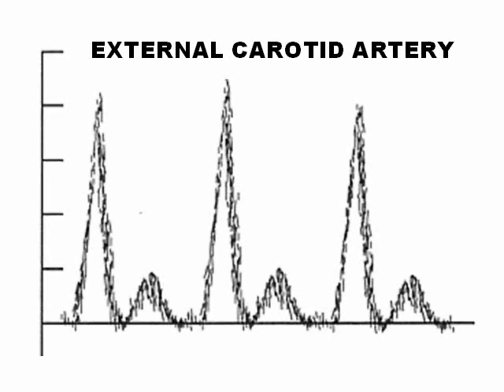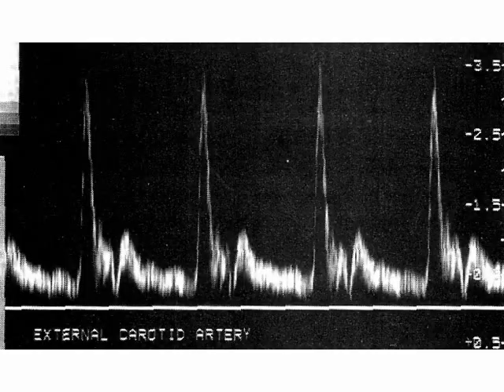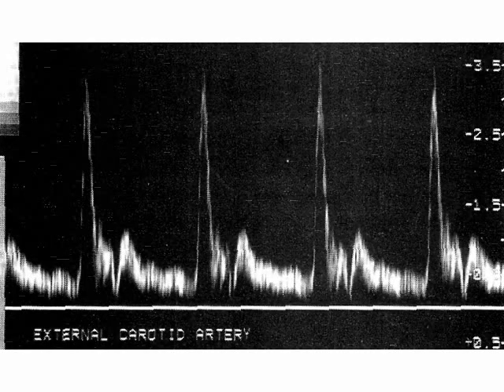This is the characteristic of external carotid artery: peaky and low end diastolic flow. This is how you really see an external carotid artery spectral Doppler on the screen.